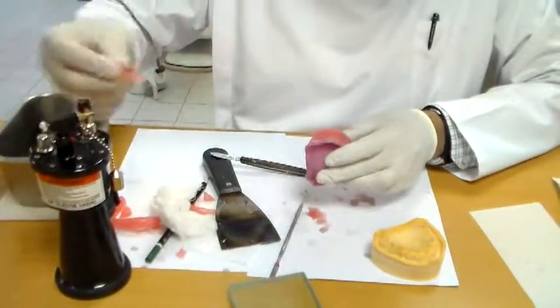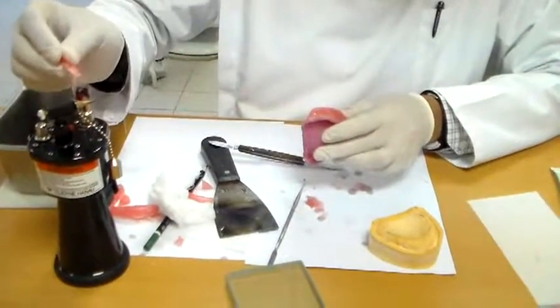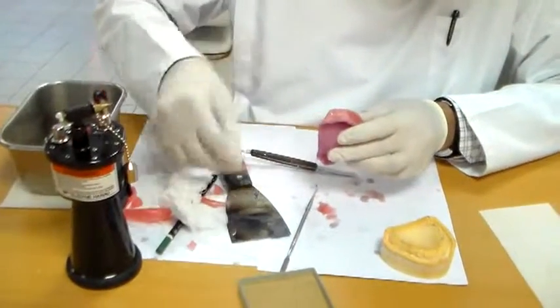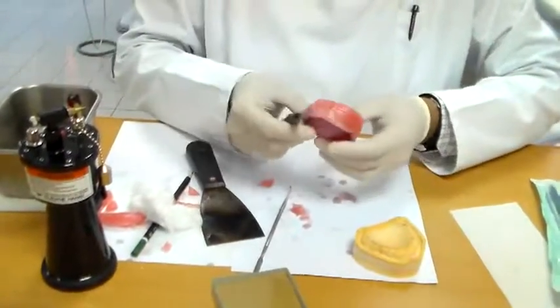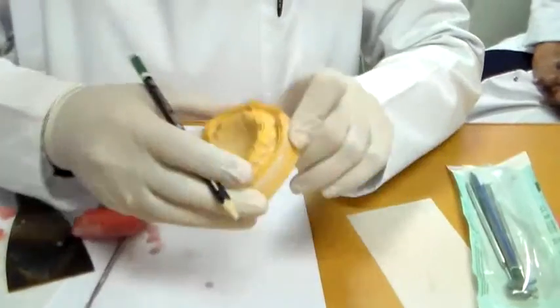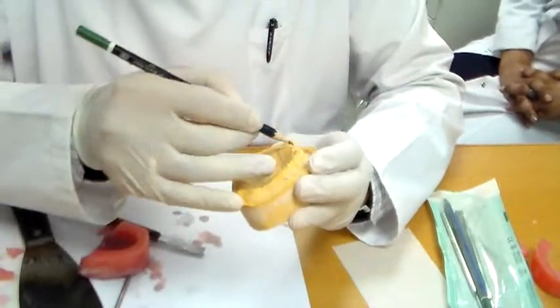Small plane deficiency. So that is reasonably done. I want to mark my canine eminences out here. It's not very prominent, so I'm going to mark my incisive papilla. Mark my incisive papilla here. I'm going to cut my incisive papilla across. Draw a line across that. Okay, approximately to identify the area of the canine.